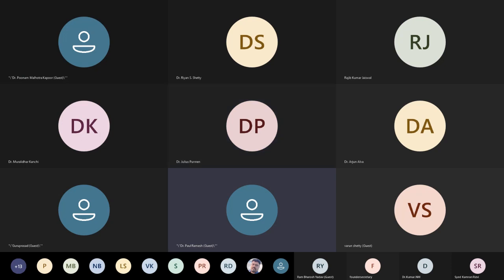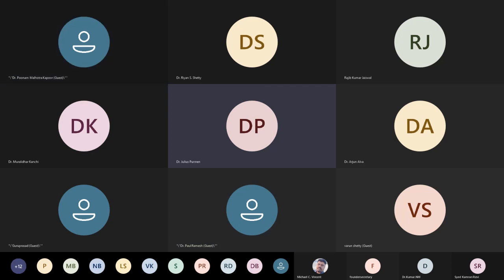Thanks. We only resuscitate patients who are on the list or who are witnessed in hospital. The longest external cardiac massage for which we had a successful ECPR was about 70 minutes. This was quite some time ago, about 6-7 years ago. But if it's a witnessed arrest, and as Riyan was saying, if the cardiac compression is good, then I think you can go for it. We do not do out of hospital arrests at all. I have been able to take a child through after 1 hour of effective massage. I mean, the child already had a line, and we were able to tell it is effective compressions. So we put on.